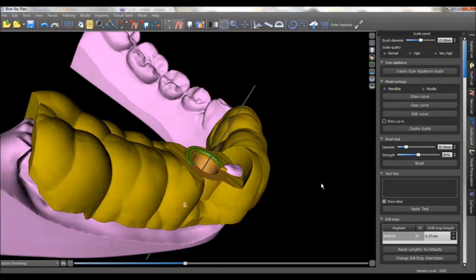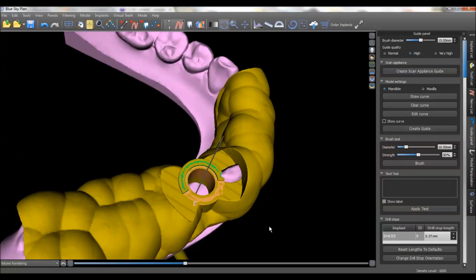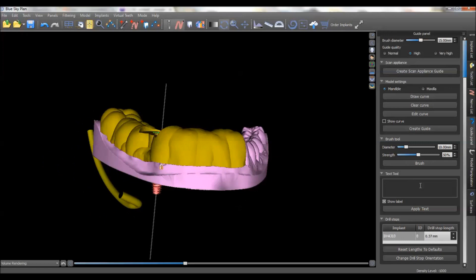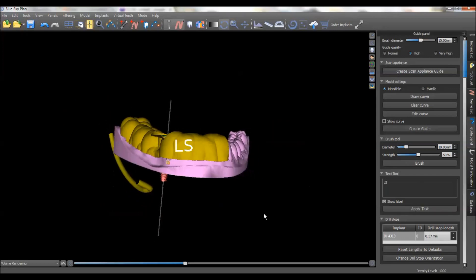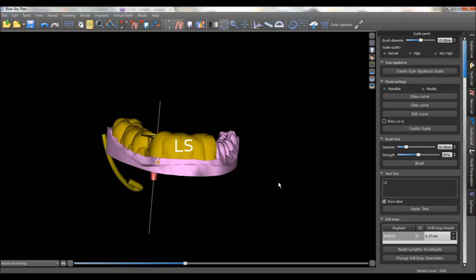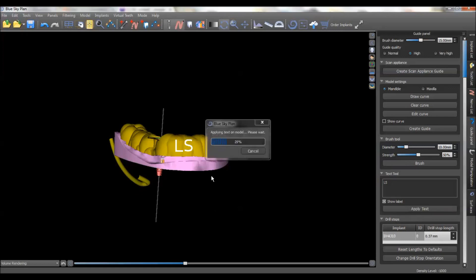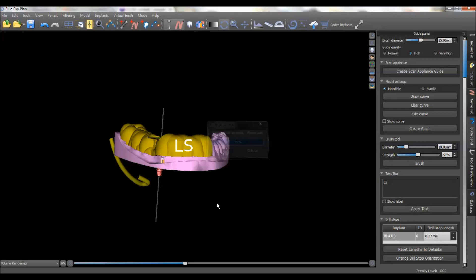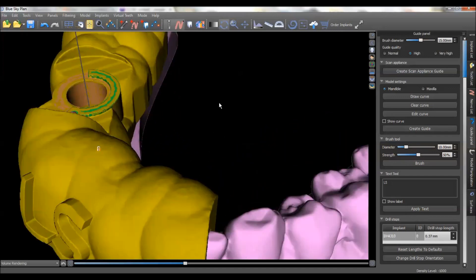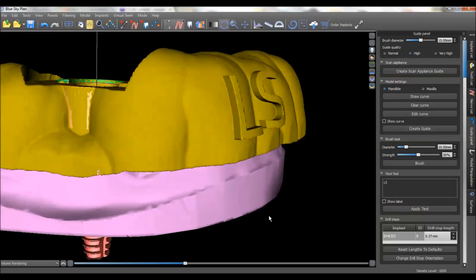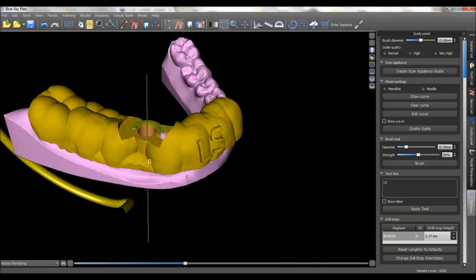And here's what we come up with when we have our guide designed. Very simple — if you wanted to, you could come in here and put in the patient's initials. You can position the text as big or as small as you want, and then once you hit 'Apply Text,' it's going to emboss this into the guide. So if you've got a lot of cases going and you're having trouble keeping track of all the guides, you can at least have the patient's name in there.